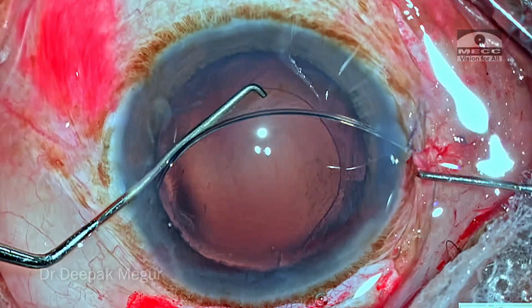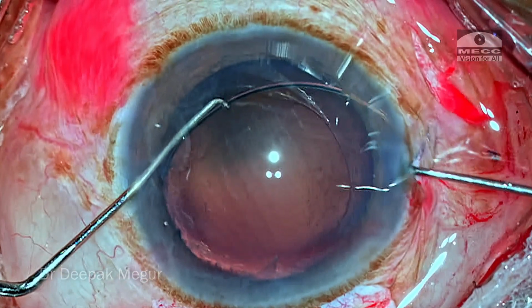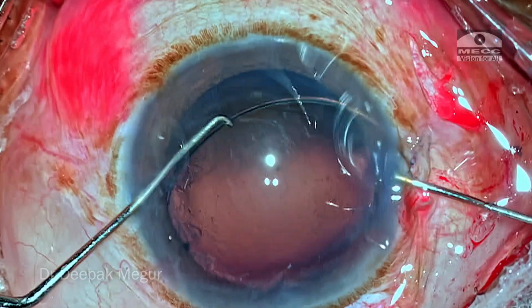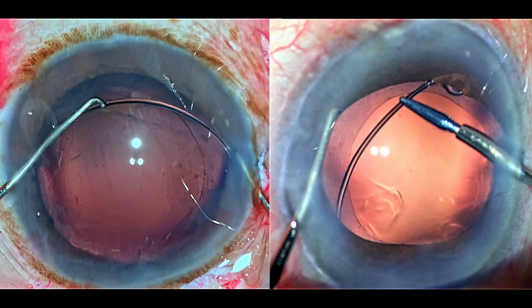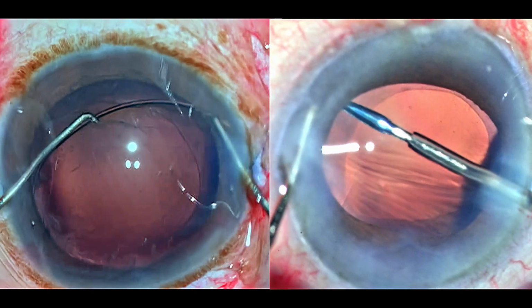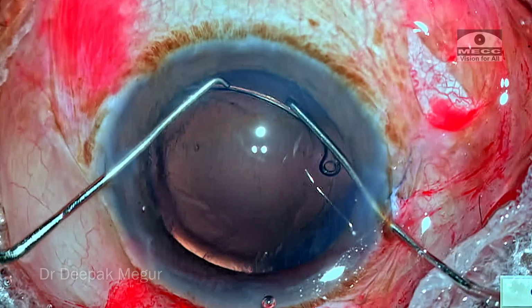but eventually gets hold of it, and the moment it passes under the side port, again he loses it, and now we have a ring of which one end he's unable to grasp. The option which he had was to use a microforceps, hold it there itself and then negotiate it, but he wasn't confident of that as well. But the good thing which he did was he never left the left hand. So the majority of the ring was still in the bag itself.